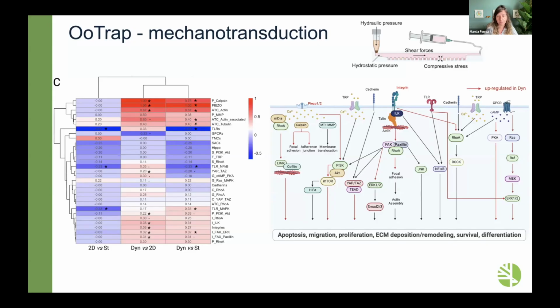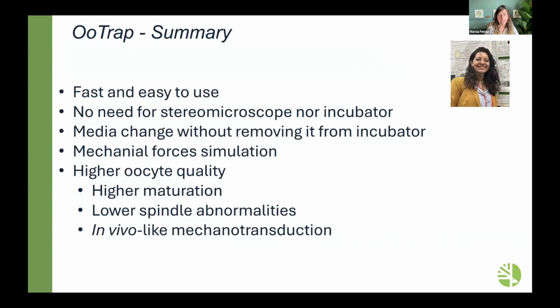So now we've been doing embryos in those devices, and we are just waiting for the RNA sequencing. The embryo rates are the same, I have to tell you. We didn't see improvement in embryo development, but we want to see if we can improve embryo quality.